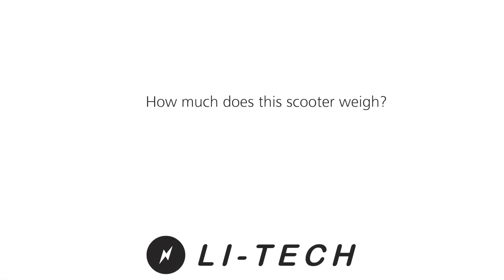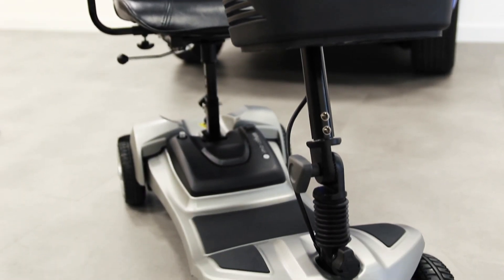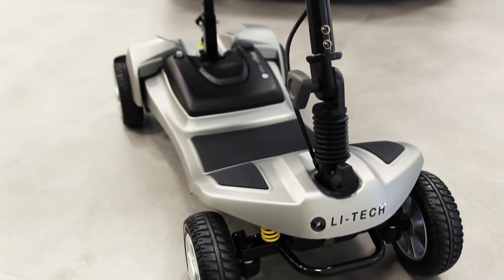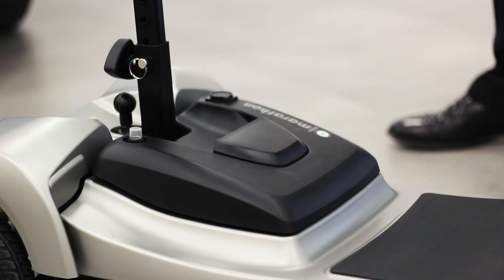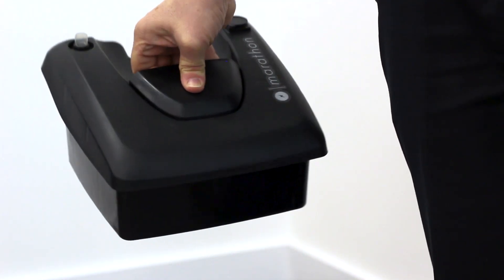How much does this scooter weigh? The total weight of the LIHTEC Marathon is 41 kilos and its heaviest piece is 15 kilos. One of the benefits of having a lithium-based battery is that it's lighter than standard scooter batteries.